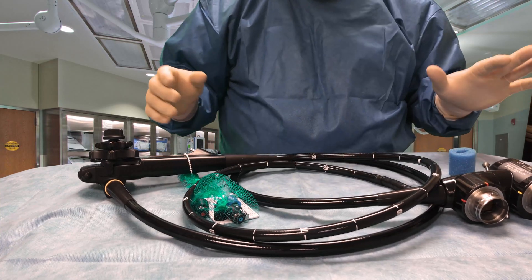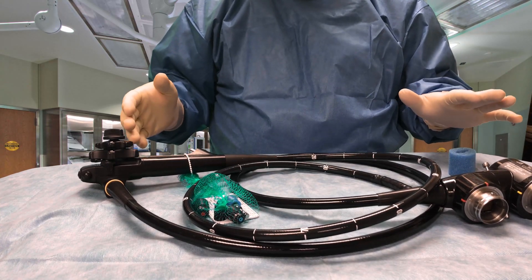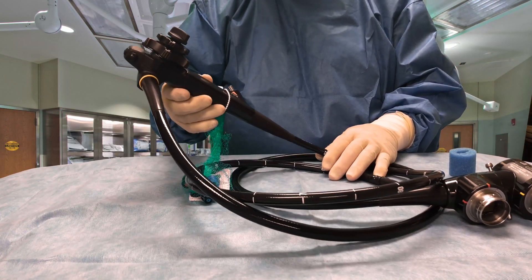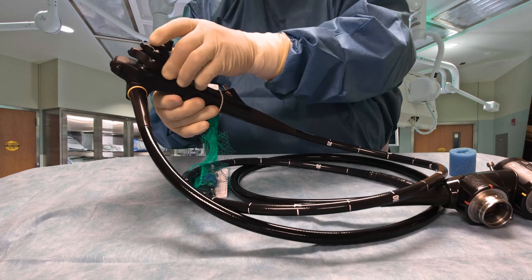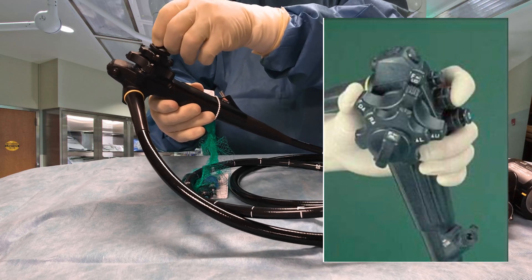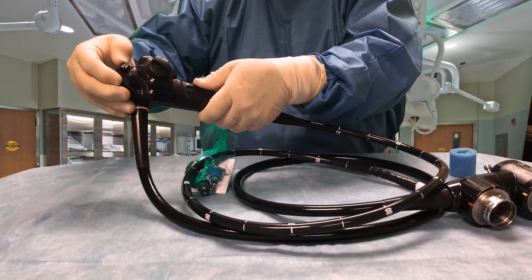This scope works just like most other endoscopes. It has a control handle here, it has the angulation controls right here, and it has the angulation locks here and here.